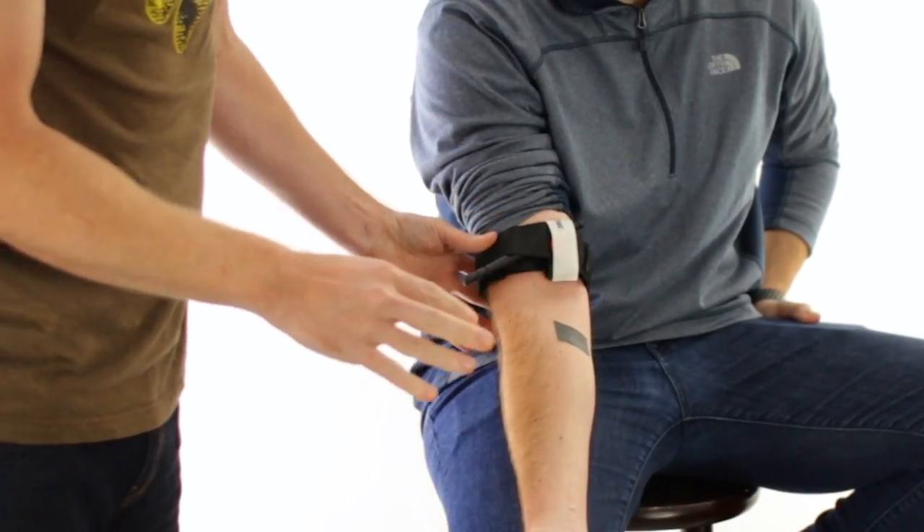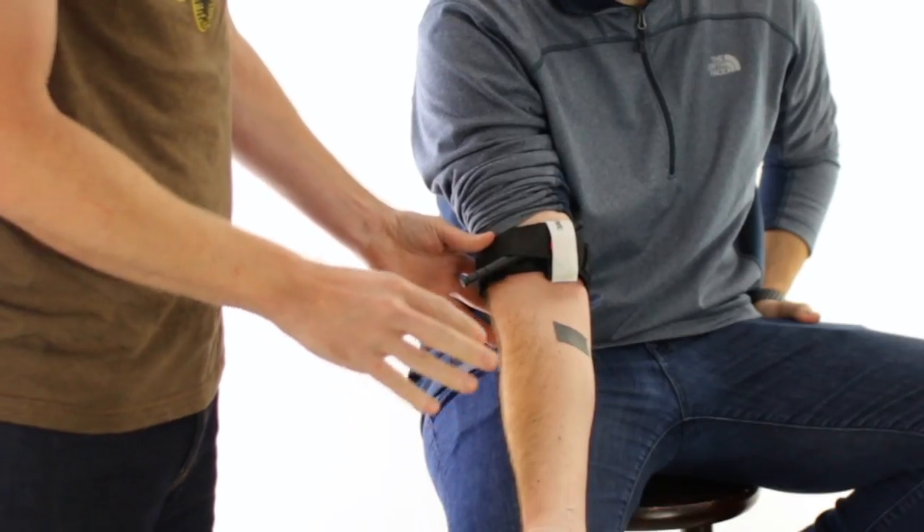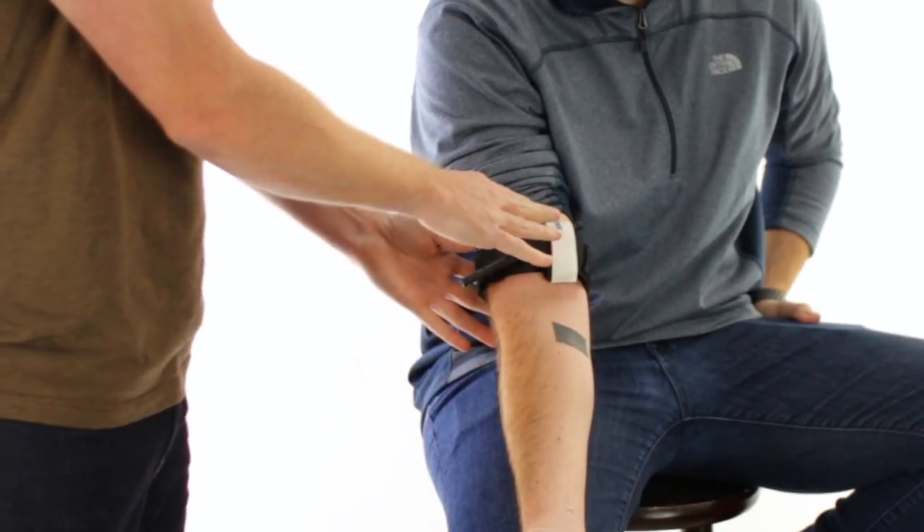A few considerations to make this successful: make sure you take out enough slack out of the band before turning the rod.